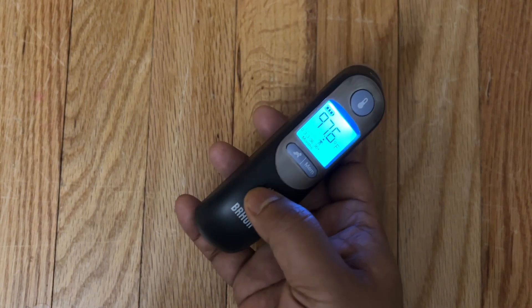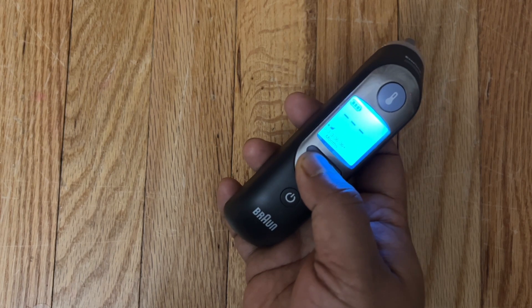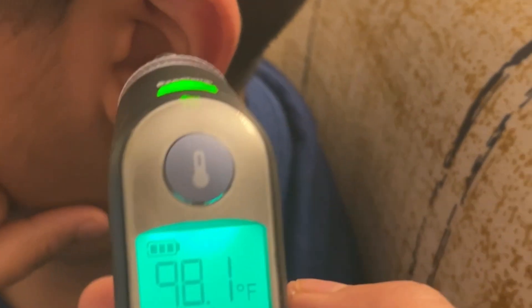It also comes with 21 disposable cups, and you could even hang it on the wall. For quick setup, you select whether it's a child, choose the age, and with the press of a button it measures very quickly.